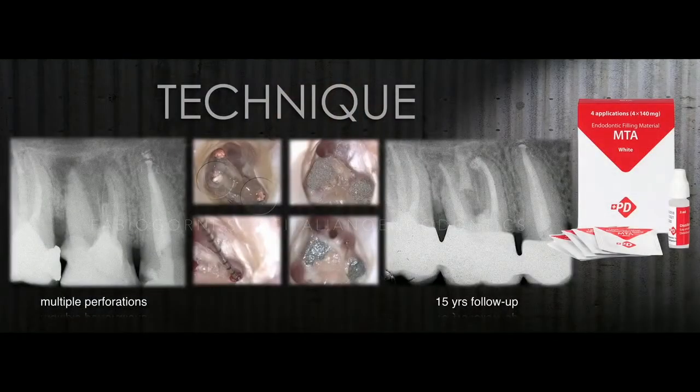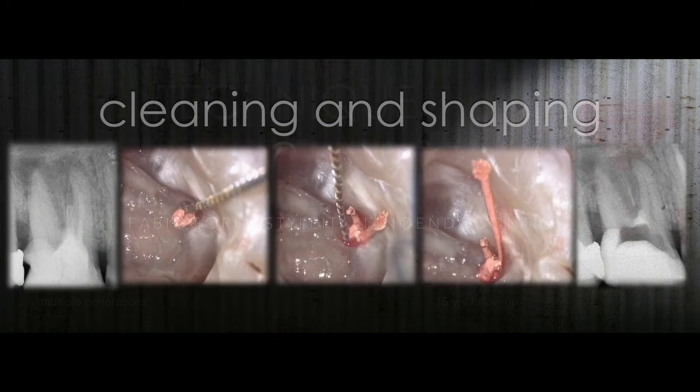Now I want to show you the technique step by step. That is really important, because we have to follow specific steps if we want to reach success. This is one of the first cases that I treated more than 19 years ago, and it was a big problem in an upper first molar with a multiple perforation, and the final result 15 years later is a great result. But now I want to show you the procedure step by step.